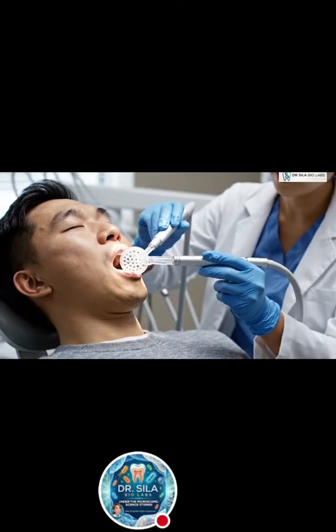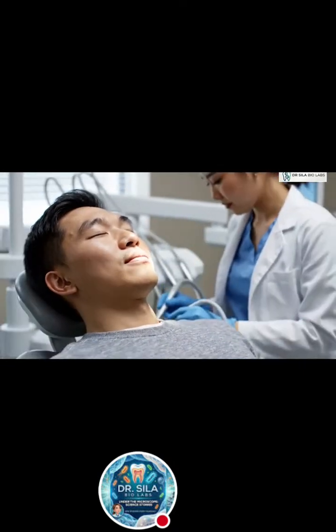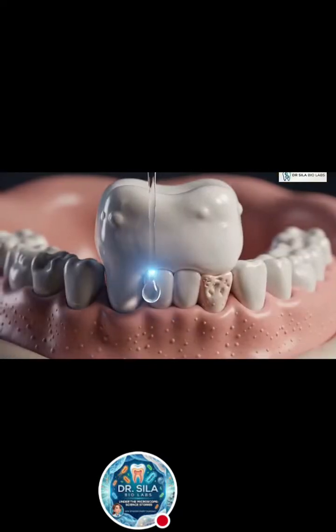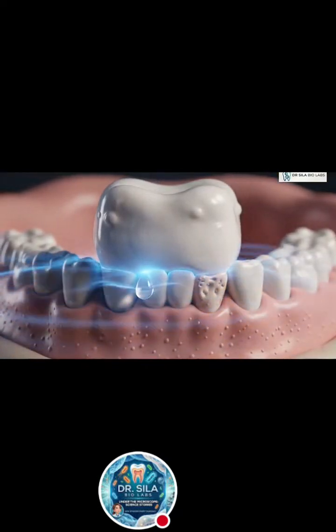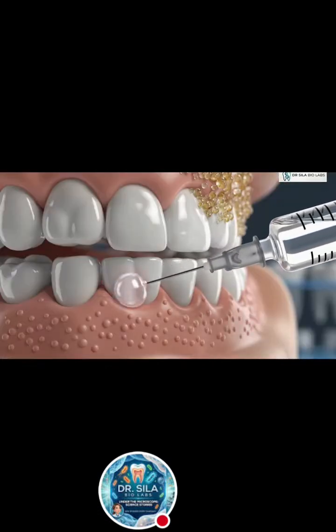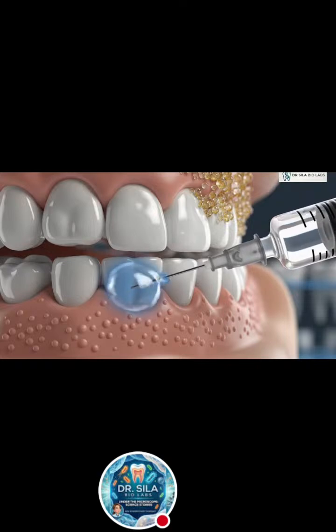At the same time, cooling water is delivered throughout the procedure. This water helps keep the tooth and instrument cool while washing away debris. Cold water or contact with sensitive root surfaces can occasionally produce a brief, sharp sensation. For deeper cleaning procedures, local anesthesia may be recommended.